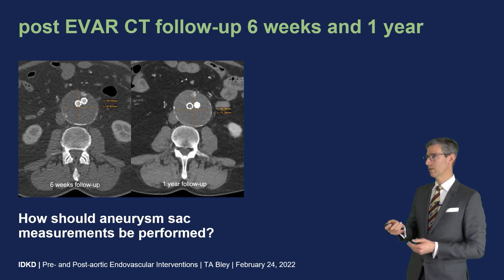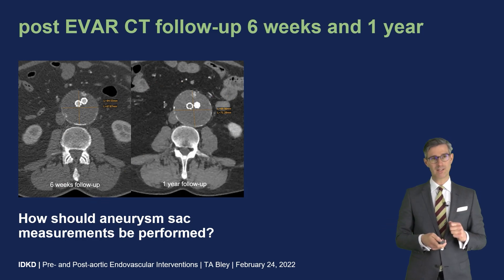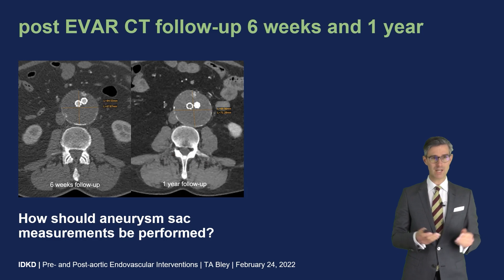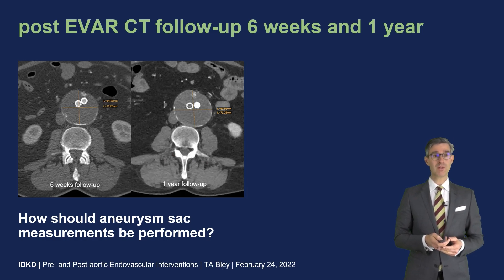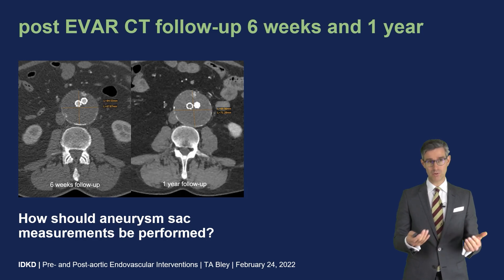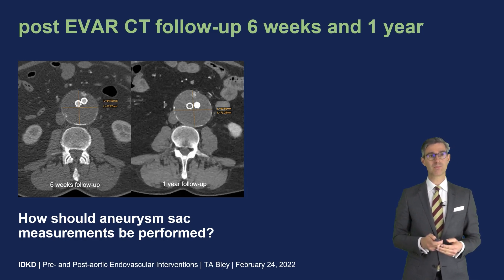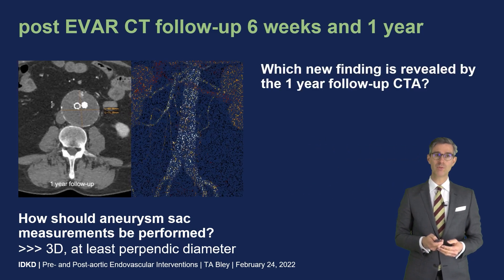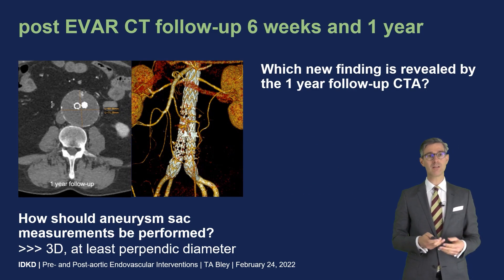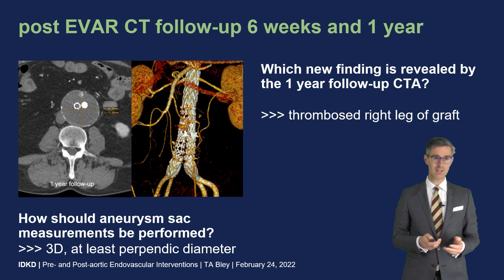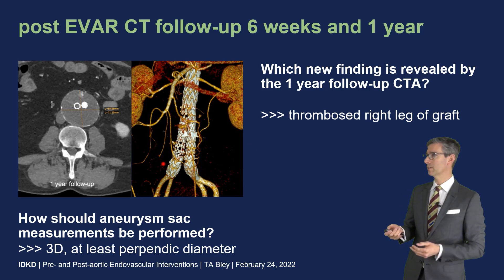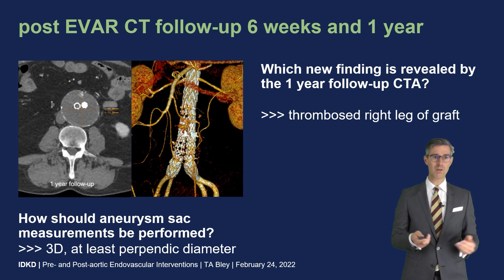Back to our case: we already saw the six-week follow-up scan, and now the one-year follow-up scan reveals one more finding. How do we measure the aneurysm sac? Ideally it would be a 3D volumetric analysis; however, in my department due to high volume we perform perpendicular diameter measurements to assess volume increase. There is also a new finding visible on the 3D VRT image: thrombosis of the right leg of the graft. You can virtually look through the stent graft because there is no contrast in the right leg — only thrombosis.